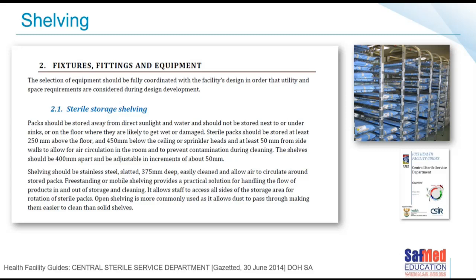Packs should be stored away from the direct sunlight, we've spoken about already. Not next to or under any sinks where they could get wet or could get damaged. Packs should be 25 centimeters from the floor, 5 centimeters from the wall, and 45 centimeters from the ceiling height. And this is all to allow for the circulation of air, a very important concept. If you have a fire safety sprinkler system in the pack room or wherever within your CSSD department, be careful about placing packs directly under sprinkler heads, as that could cause a leak.